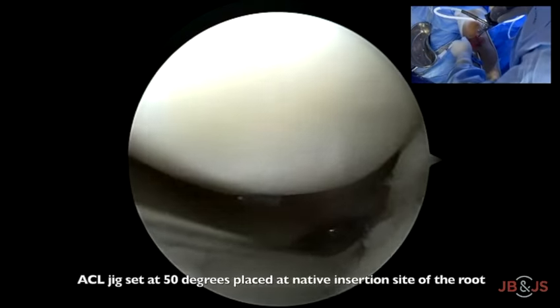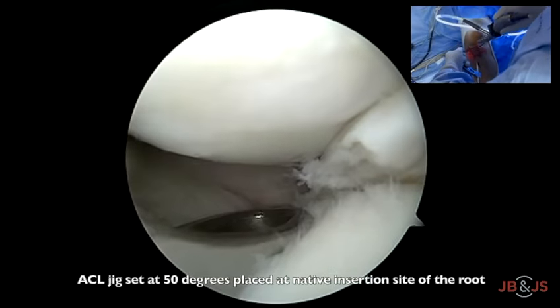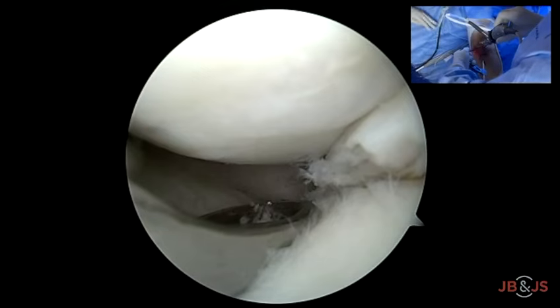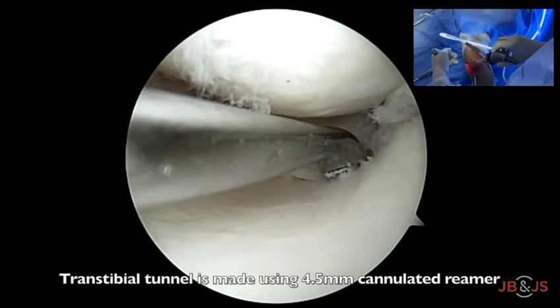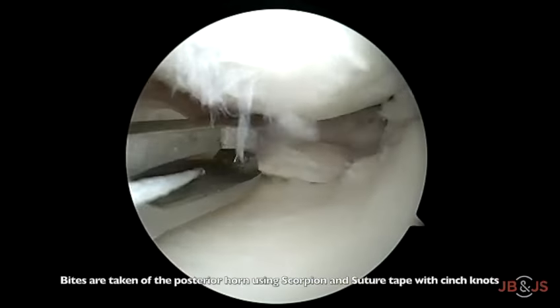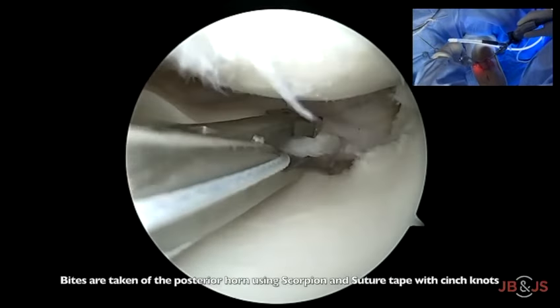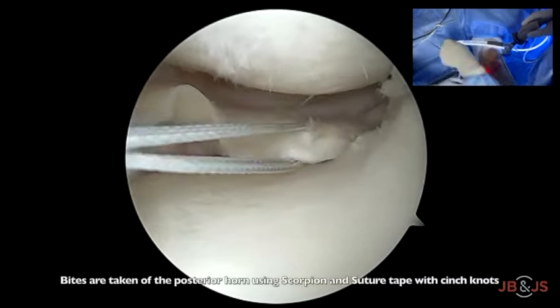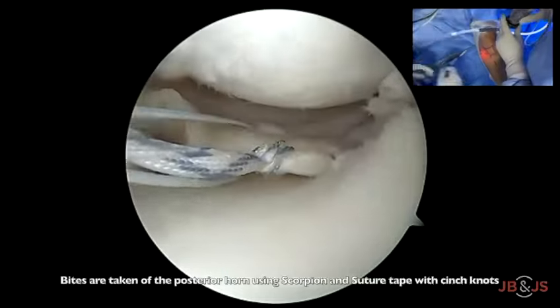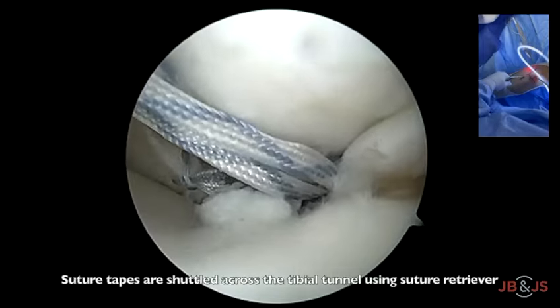For creating the transtibial tunnel, an ACL jig is set at 50 degrees, placed over the posterior root area, and reamed with a 4.5 mm cannulated reamer over a guide pin. Bites are then taken of the posterior medial meniscus with a knee scorpion using two non-absorbable suture tapes with cinch knots. These sutures are then shuttled across the tibia using a suture retriever. Knot tying is done after centralization.